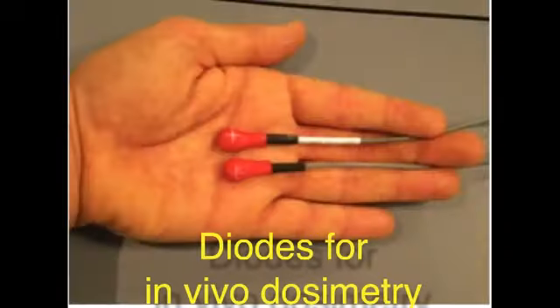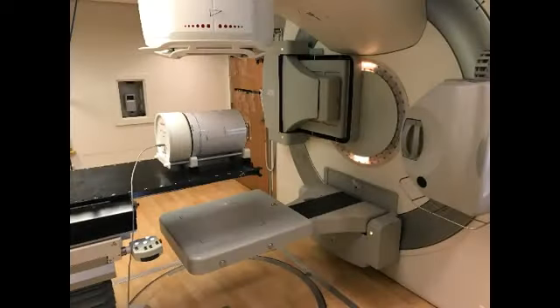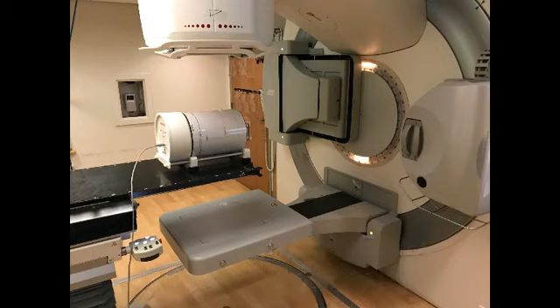You've already seen these. These are diodes for in vivo dosimetry. You can go back and look at video 17.1 to see this. The problem is these are just single point measurements, so they're not great for looking at spatial variations in an IMRT field. We talked about this. This is an EPID QA. You could do this with the patient in the beam, and that would be called in vivo epidosimetry. In that case, you're measuring the exit dose from the patient, and you can backtrack and figure out if it's what it should be coming through the patient.